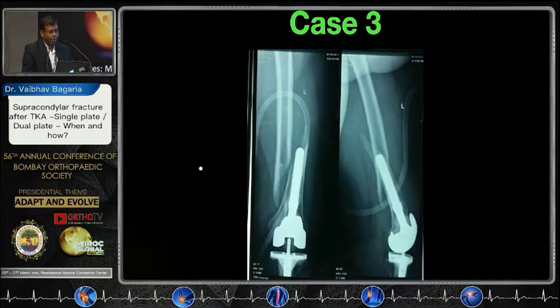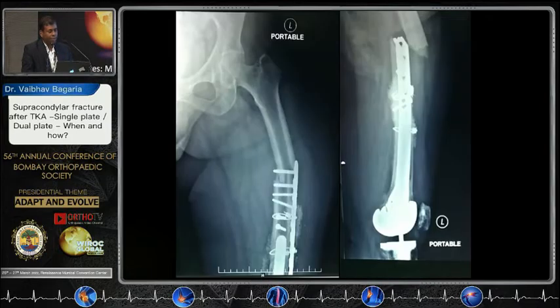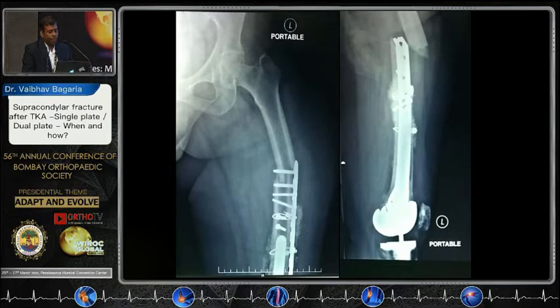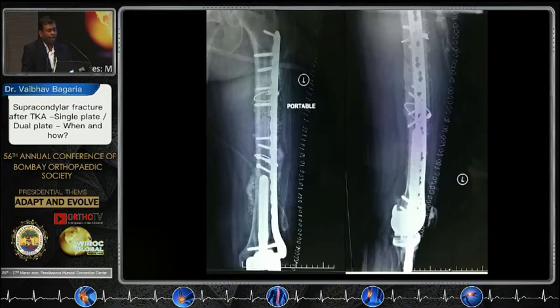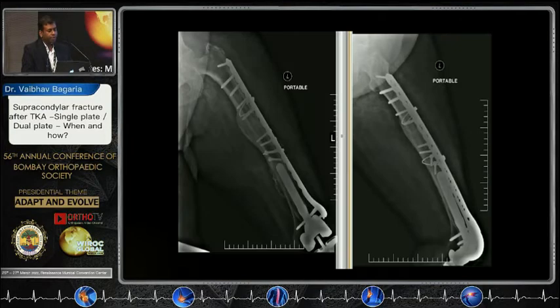A similar situation: this was not my primary case, but I helped in the second part. There was a re-fracture of the periprosthetic site — you can have re-re-fractures that are very challenging. In that situation you have to think about allografts, massive allograft, and spanning the fixation much beyond the fracture zone.